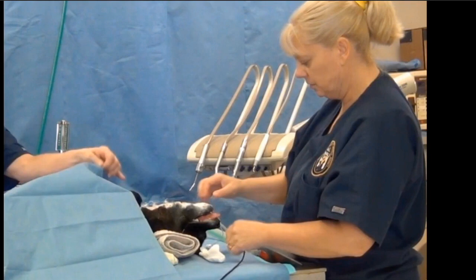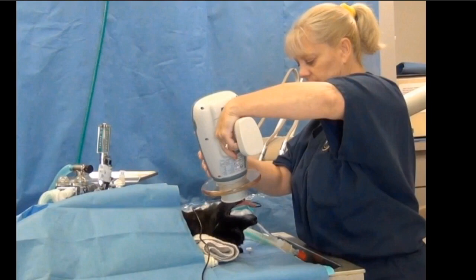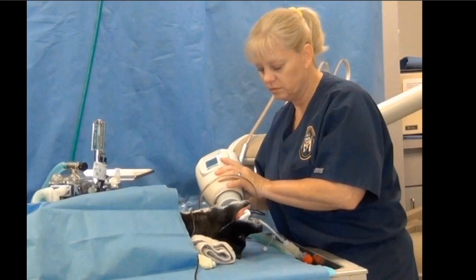The first thing we're going to do is go to the same side of the table, which is now the left side of the patient. We take the image there, which is actually a parallel image — we just put that sensor parallel to the mandible and shoot straight at it, just like you would taking an abdomen or chest rad on your dental machine. The patient is sandwiched between the tube head and the plate, and you shoot straight on. Same thing for the caudal mandible, but then we use our angles going forward because the symphysis will be in the way. Then about 70 degrees for that shot, then parallel back on that side. That is every single patient.